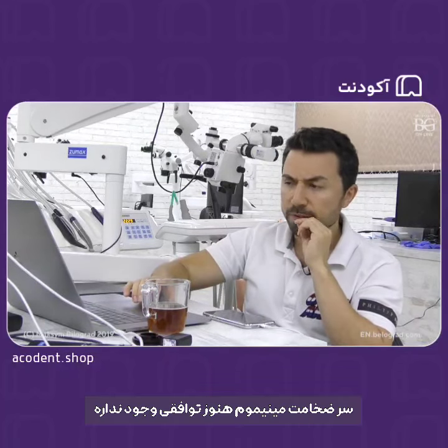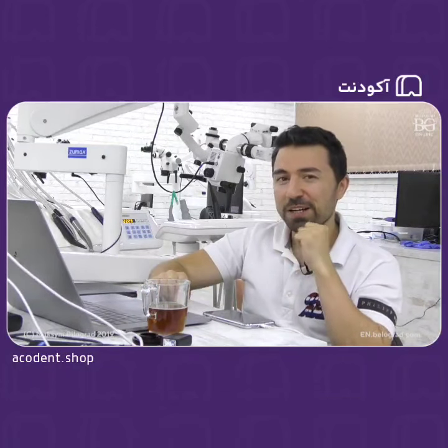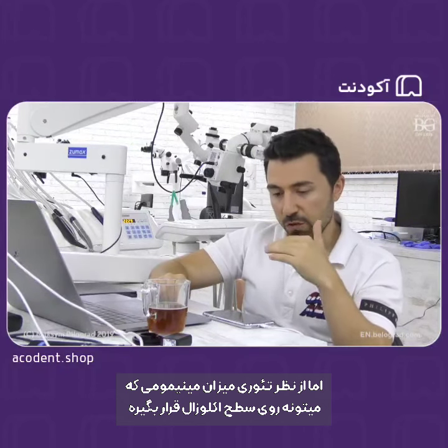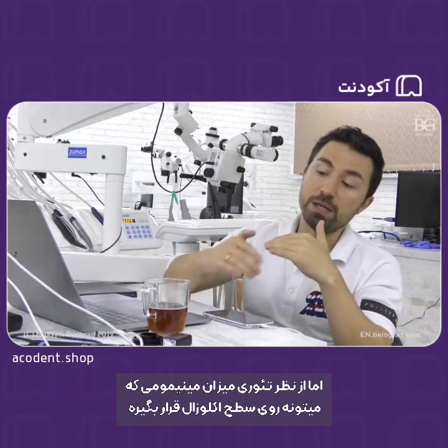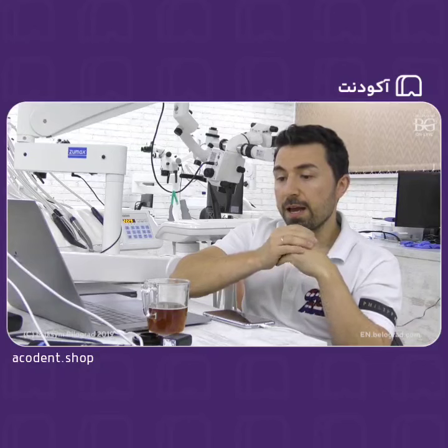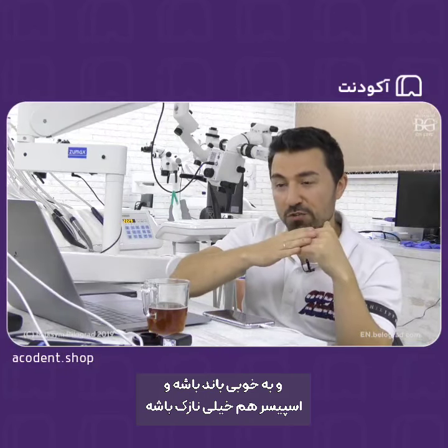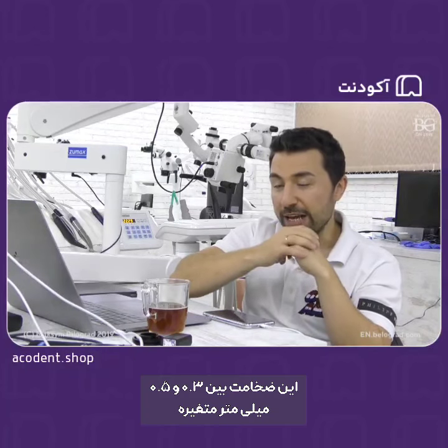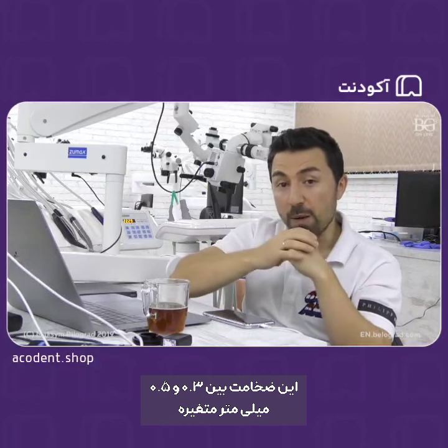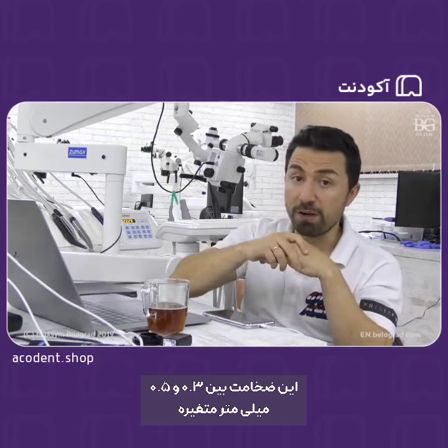So, the minimum thickness is a controversial topic, but theoretically, the minimum thickness of ceramic that can be placed over an occlusal surface and bonded properly, with a really thin spacer, may vary from 0.3 to 0.5 millimeters.